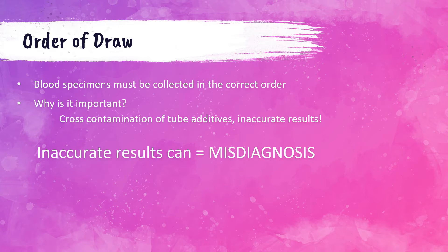Potassium and calcium are not tests that are run on this type of tube, but if this tube's additives contaminate a tube that is used to run potassium and calcium levels, you're going to run into big problems — the potassium will be falsely increased and the calcium level will be falsely decreased. This could lead to a misdiagnosis and have serious consequences if the physician treats the patient based on these inaccurate results. We have to be advocates for the best interest of the patient, and following the order of draw is absolutely imperative for this.